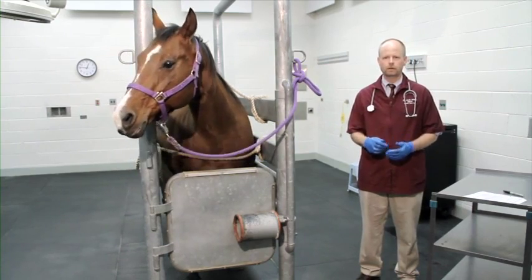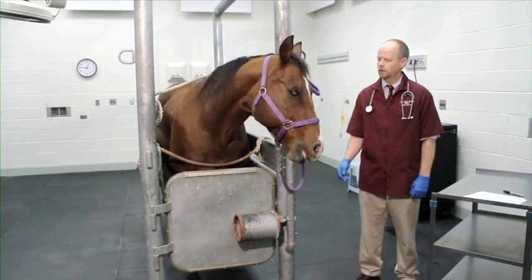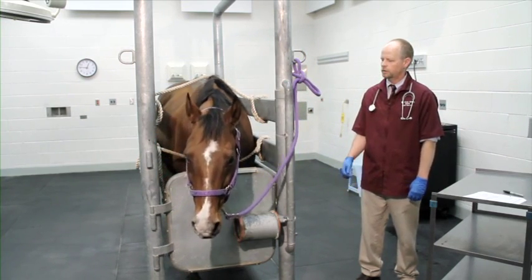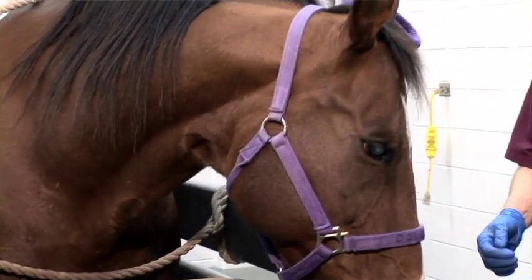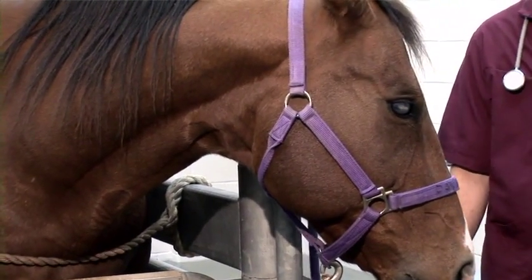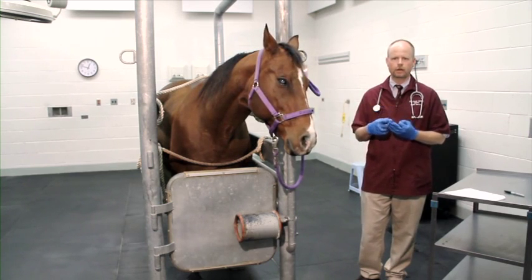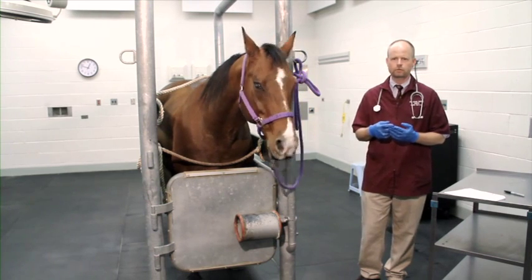Prior to administering sedative or analgesic injections for oral examination and dental procedures, it's best for veterinarians to determine the horse's overall health status by obtaining a proper medical history and performing a physical examination. We have a patient here — this is Aggie, about an 18-year-old quarter horse mare, part of our teaching herd, here today for her annual oral examination and dental maintenance. Important components of the medical history include past medical problems, current medications, and the horse's performance schedule, including any upcoming events where drug testing might occur.